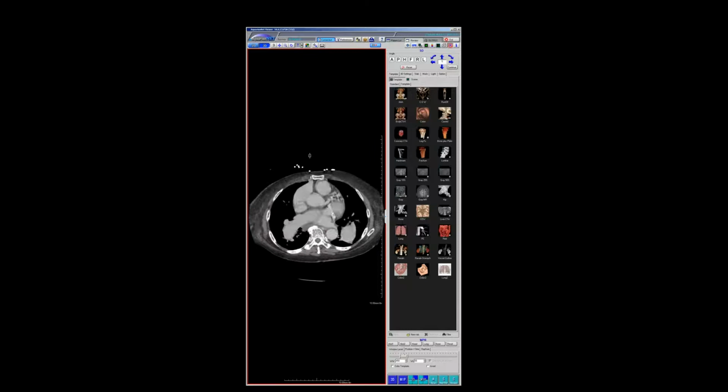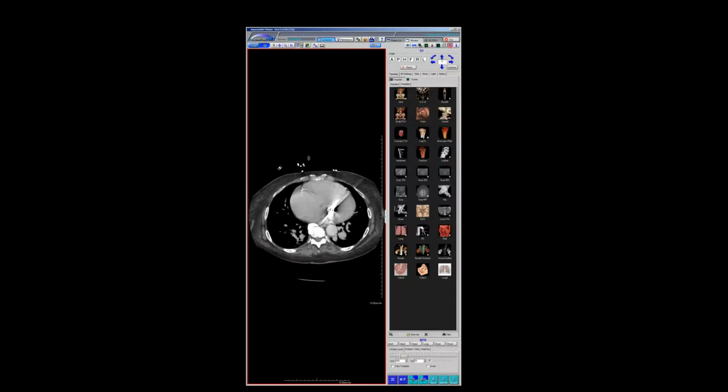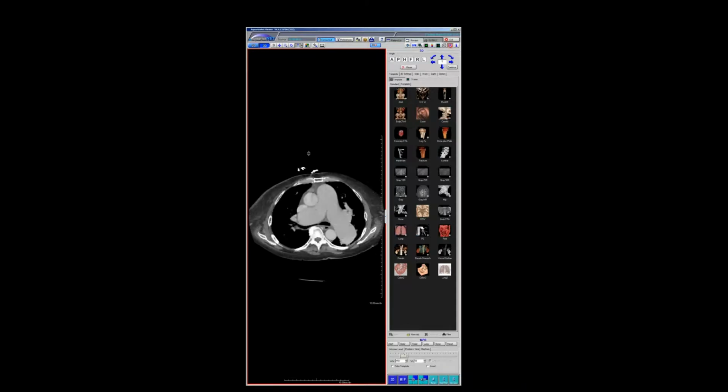With that prosthetic valve, right? There's a prosthetic valve. Yeah, they put in a mitral. It's actually a mitral clip. Okay, understood. But yeah, we have to check if they took them off anticoagulation. That was the cause of the interval development of the thrombus. That was just kind of a neat case.